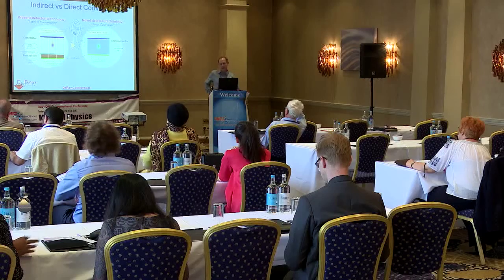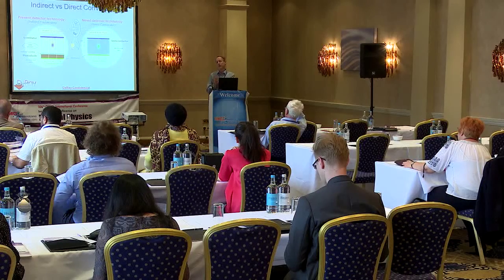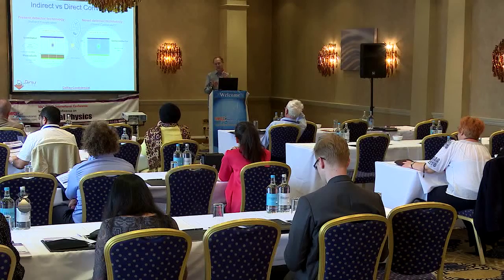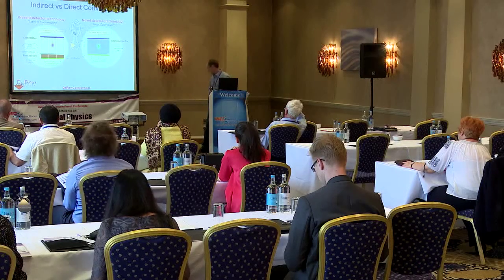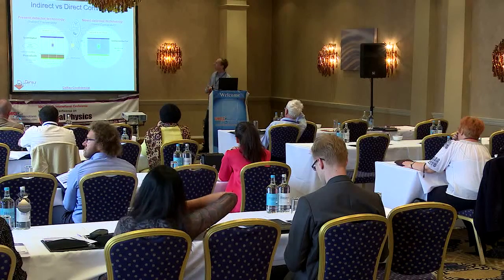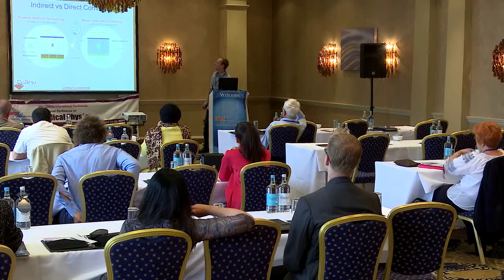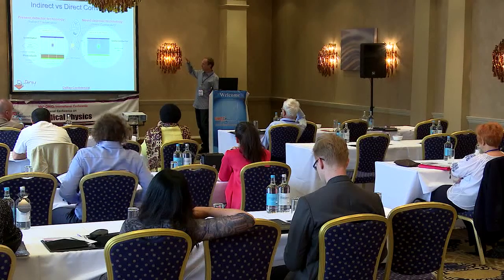And so since the beginning of the detection of X-rays, all of the devices that we've used to detect X-rays, starting with film screen systems, all the way up to the digital detectors that are used in digital radiography, the energy is integrated and we measure just the intensity. Modern digital radiology detectors often use either a scintillator or a direct conversion semiconductor, but that charge is then integrated and the signal is in terms of the intensity.